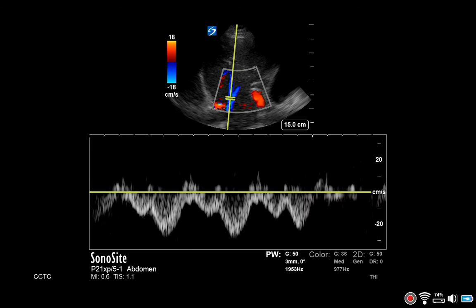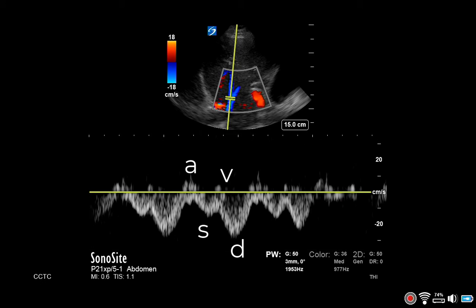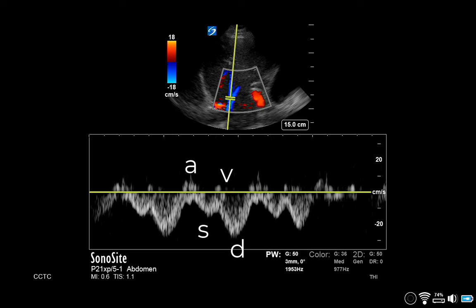In all but the most severe patterns of congestion, there is first a positive deflection — that's the A wave, or atrial kick — followed by two negative deflections: the systolic and the diastolic. A V wave can sometimes be seen between the S and D waves.